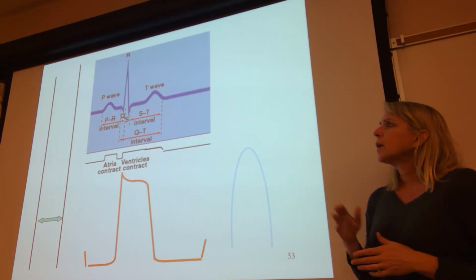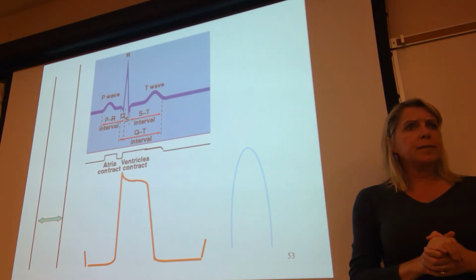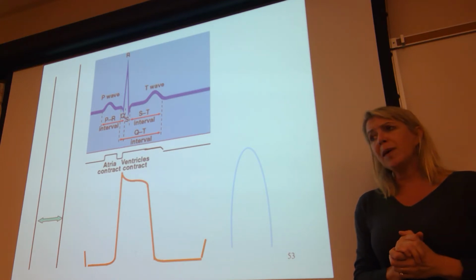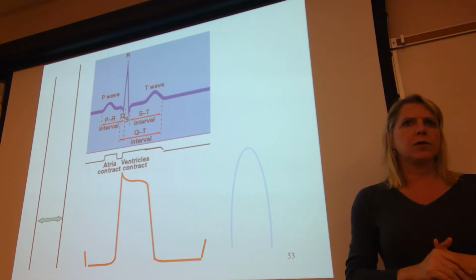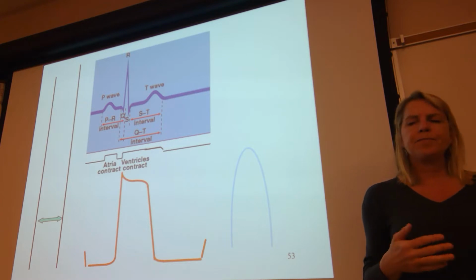On Tuesday, I said to you all, the EKG pattern, it's not an action potential. And a lot of people in a clinical setting think it is. It's a comparison of vectors. And welcome to the club. Now you know what it looks like.